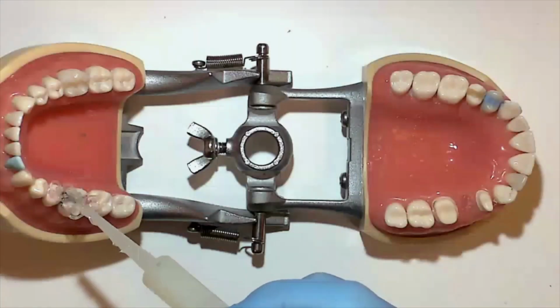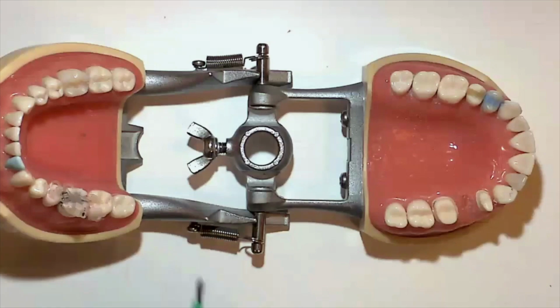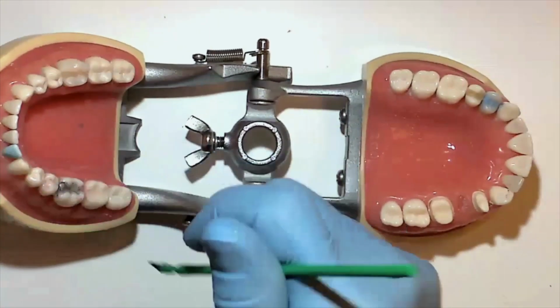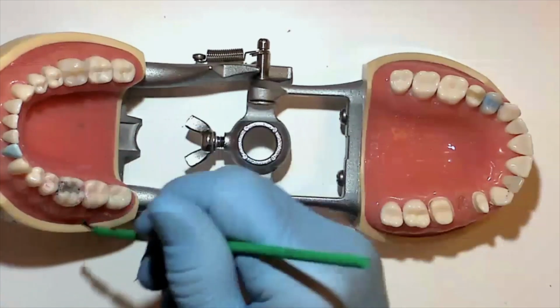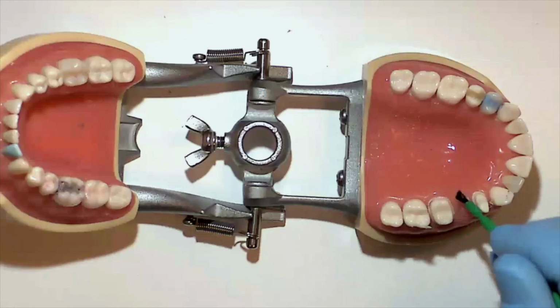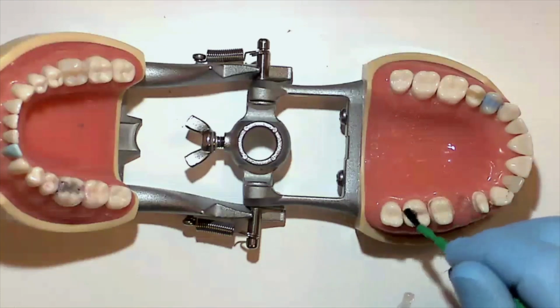We're going to lubricate the opposing arch with some Vaseline so the acrylic doesn't stick when we close and go into an excursion. Now we'll lubricate the model of the prepared teeth and the adjacent areas.